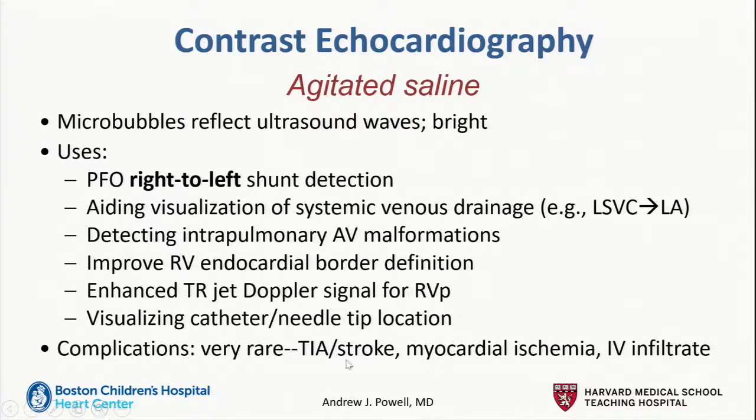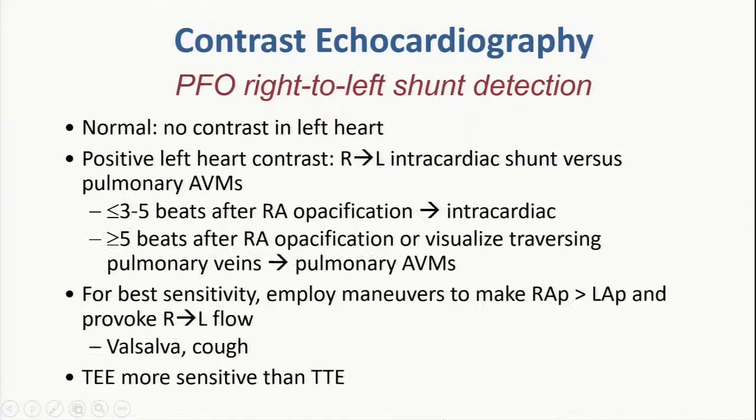In terms of complications, these are all very rare, but people have reported TIA or stroke, myocardial ischemia, presumably from bubbles making it over to the left side and down the coronary arteries. And then since we're injecting through an IV, there's a chance for an IV to infiltrate.